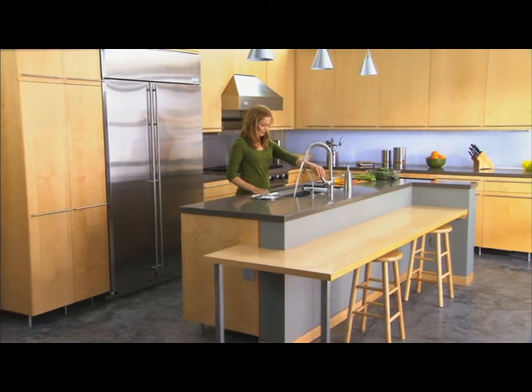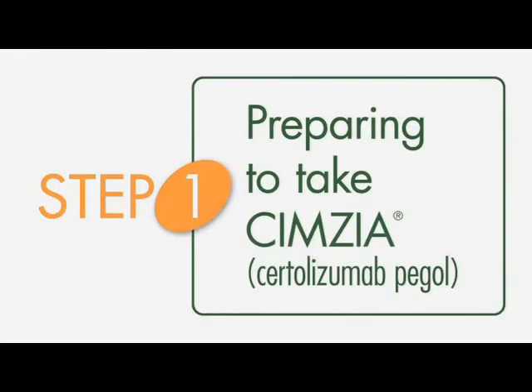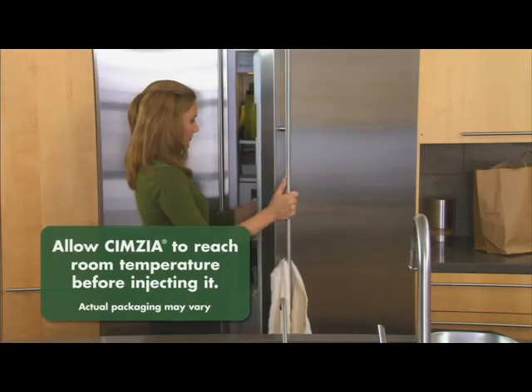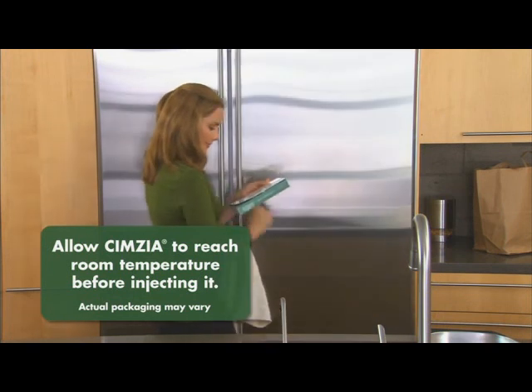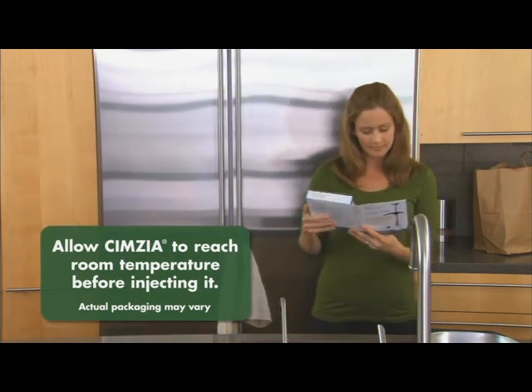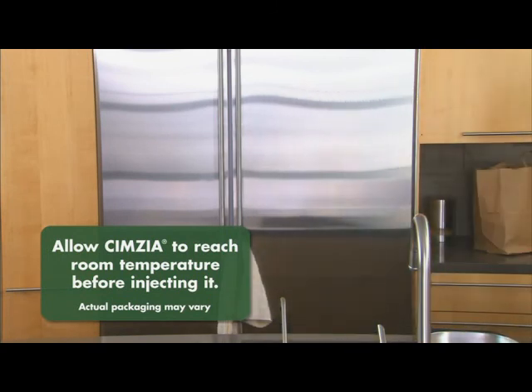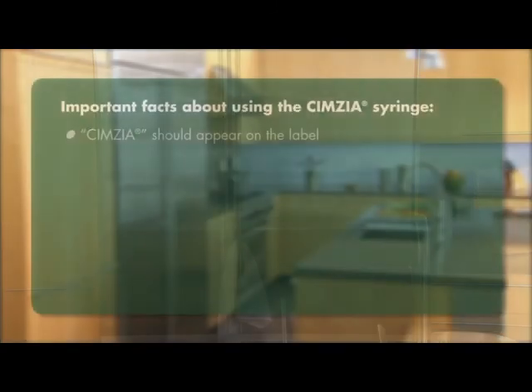Injecting Symsia is simpler than you may think — in fact, you can do it in four steps. Take your pre-filled syringe pack containing Symsia from the fridge. Each pre-filled syringe contains one 200-milligram injection. Your doctor will tell you what your Symsia dose is.